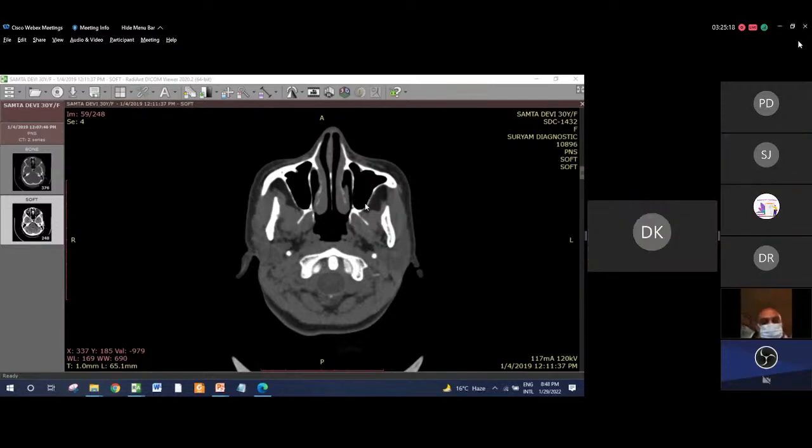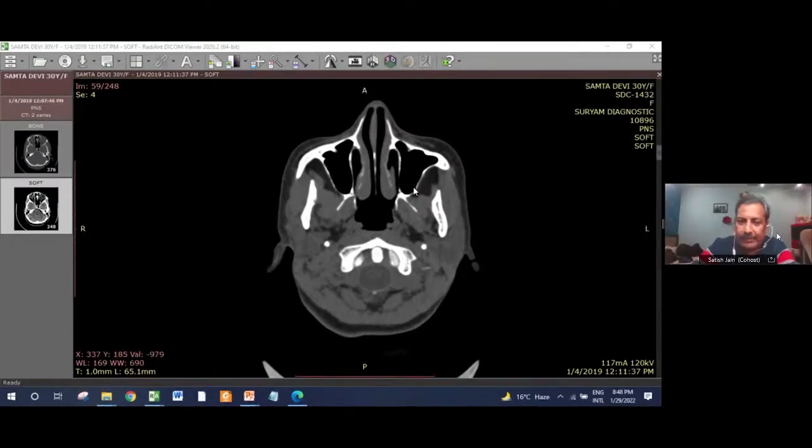I wanted to ask you, do you prepare the patient before ordering a CT scan by prescribing systemic or topical medication as a routine, or do you order a CT scan at the outset? See, the best timing for the CT, your question is valid. The timing of CT scan is very important.